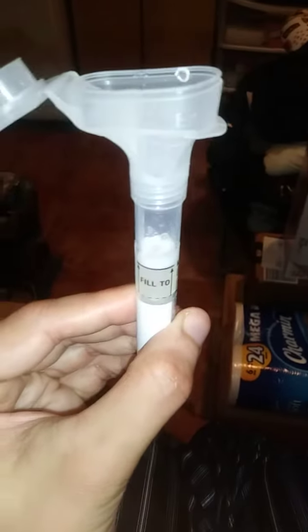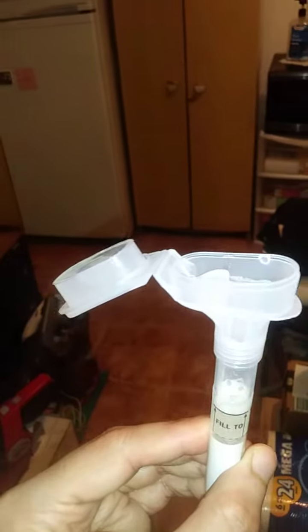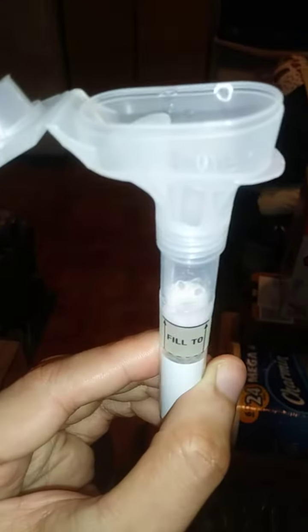Surprisingly, it's not taking too long. It's 12:18, I just made my second video a couple minutes ago. I told you I was going to fill up this tube with my saliva for the 23andMe collection, and I'm pretty much done — I'm just waiting for the bubbles to subside so I can make sure it's up to the fill line.